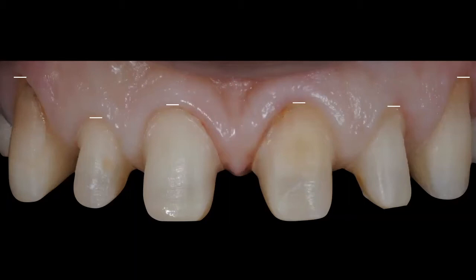And I never have any issues unless you are mixing different substrates. So you're combining, I don't know, crowns with veneers, and now you've got different thicknesses. You have maybe a tooth that is darker, and your stump is darker than other teeth. And if you choose a glass ceramic and it's not that thick, then you may have a shade difference.